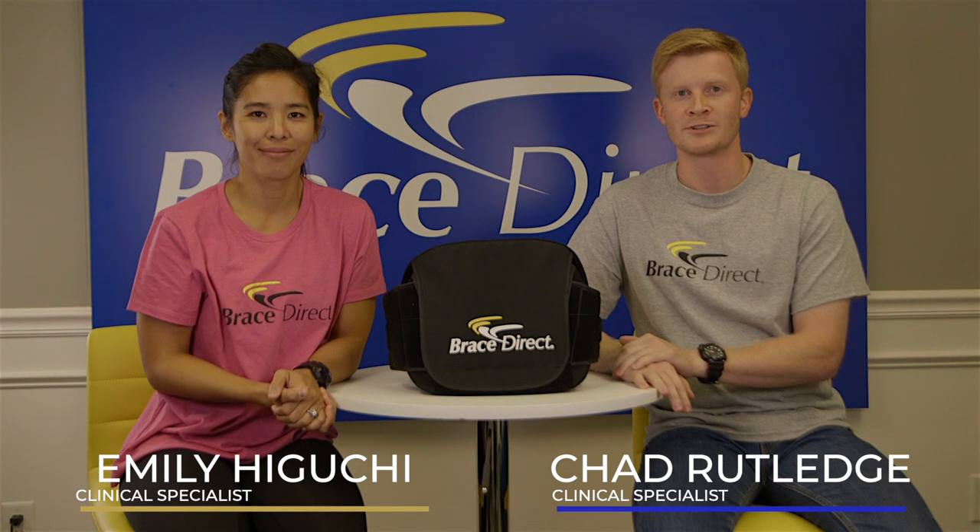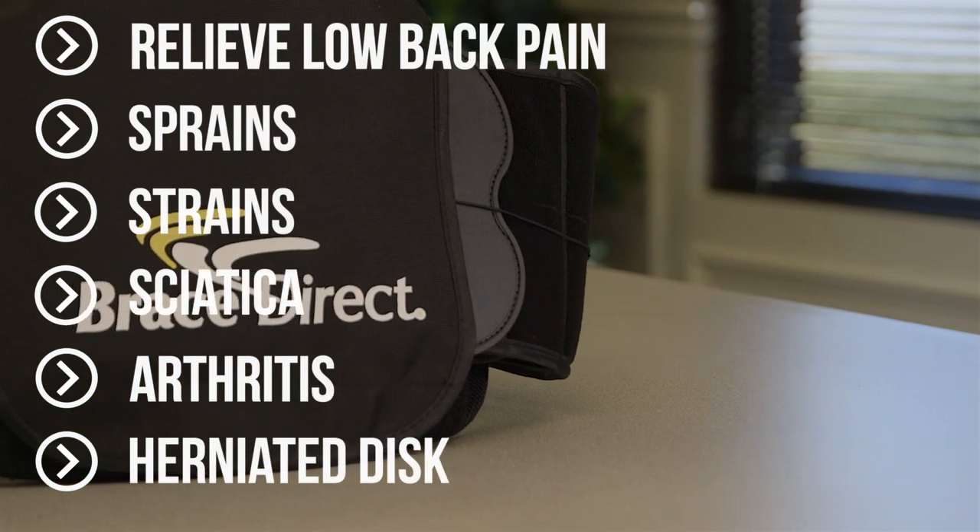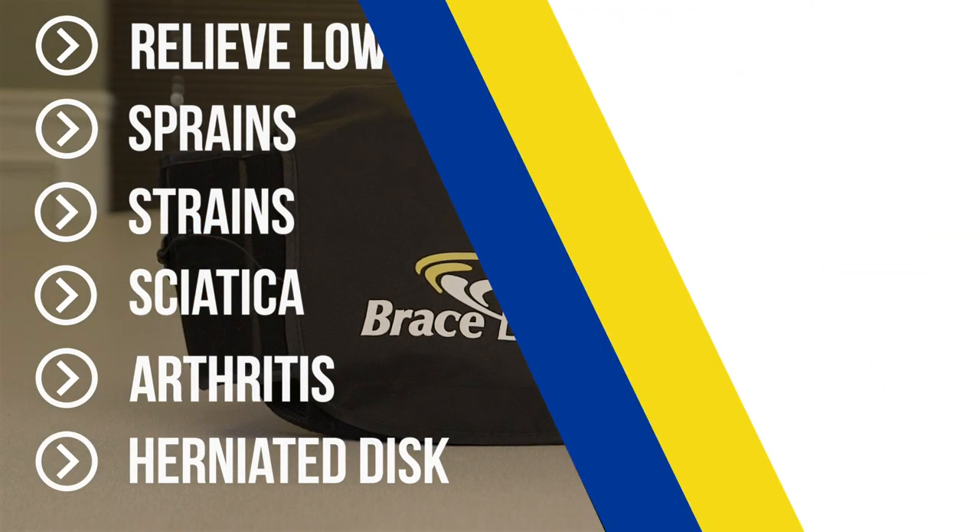Thank you for choosing BraceDirect's lumbar support. The back brace helps to relieve low back pain associated with sprains, strains, sciatica, arthritis, herniated discs, and more.